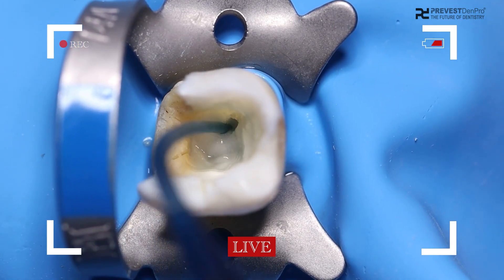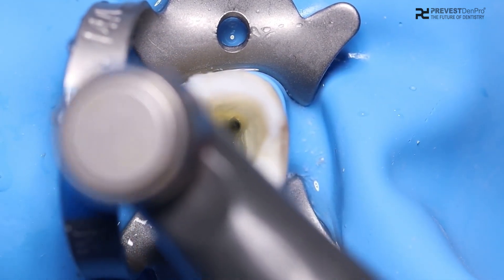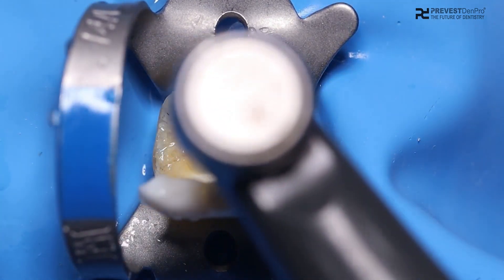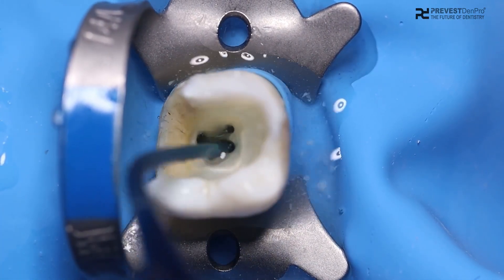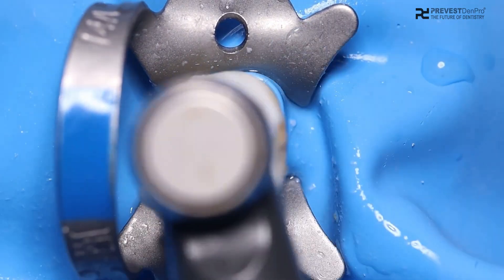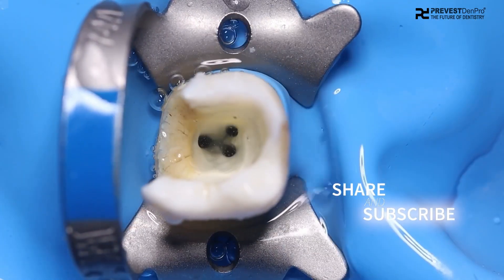After preparation of the canals, rinse with 3% sodium hypochlorite. This helps in removal of debris and simultaneously cleanses the canal. Repeat this for the other canals as well. Finally, rinse the canals with water to remove the EDTA gel.